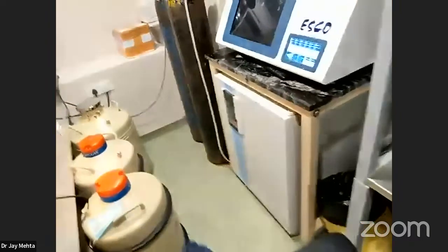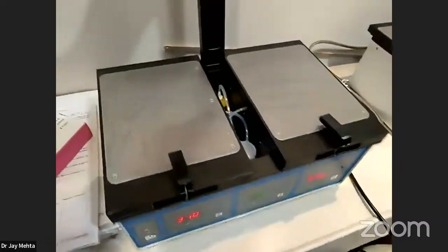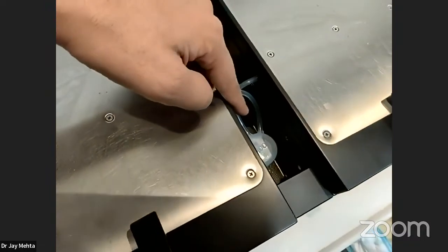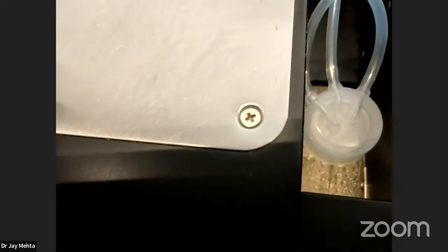Okay, then comes a very important thing. If you are using box type incubators or bench type incubators, whatever you are using, I'll just show you my box incubator. Now see, this is the old one, 8 years old. Can you see this bottle inside this? This bottle is the humidifier. This bottle will continuously pump humidified gas inside. Can you see there are some water droplets inside that?